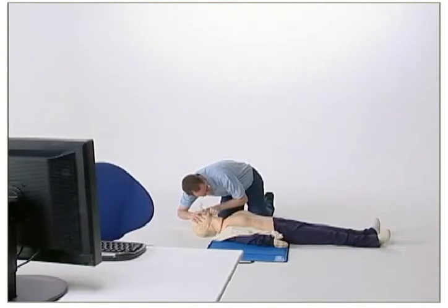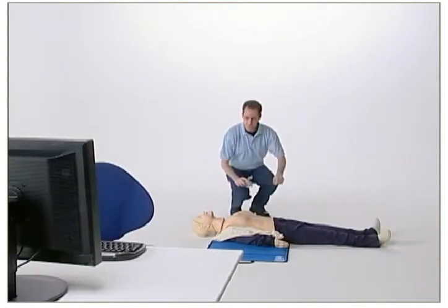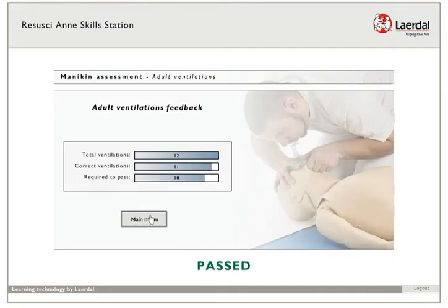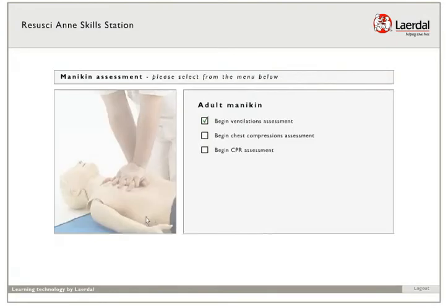Great. Continue if you would like more practice, or click stop to end this session. When you have passed the assessment, you should continue with the remaining assessments.